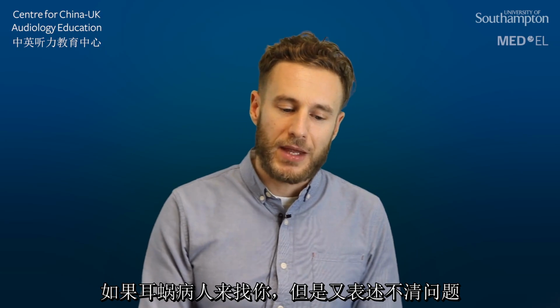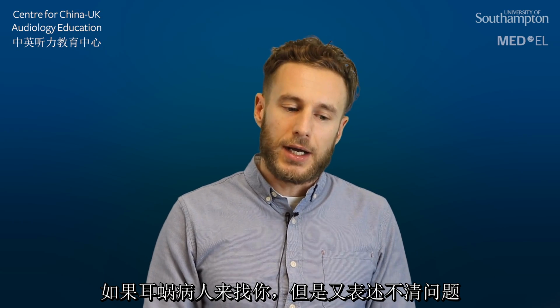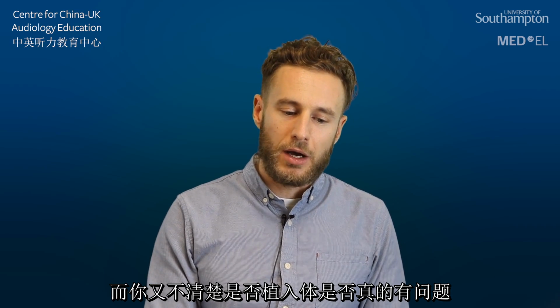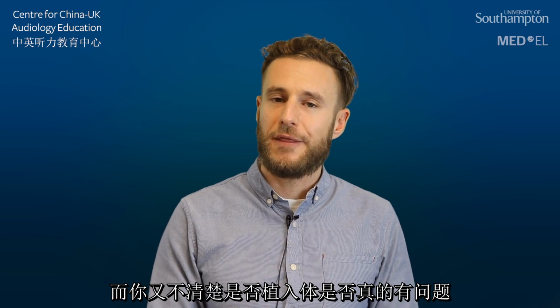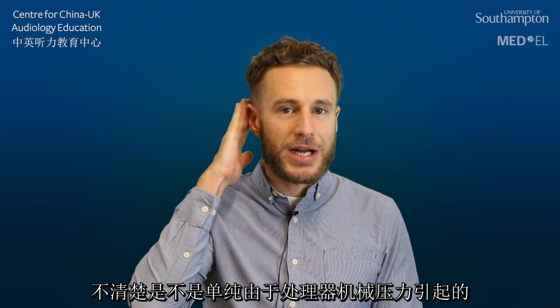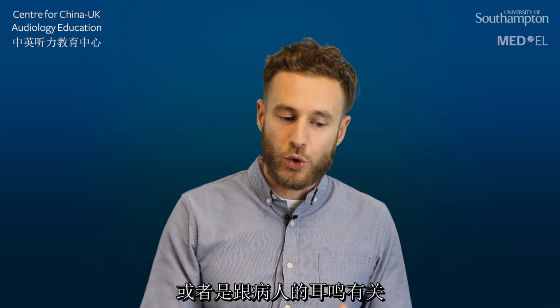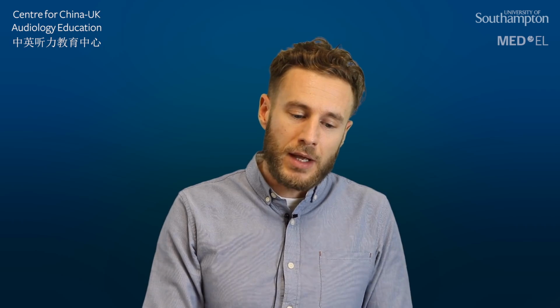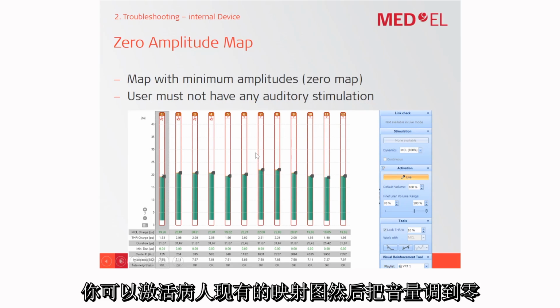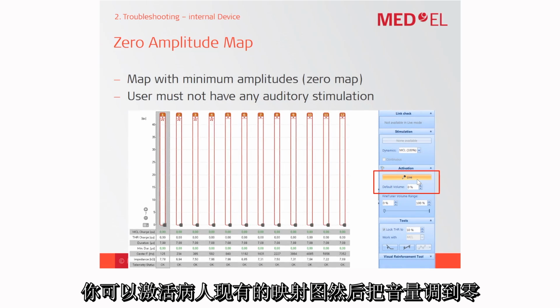As already mentioned, if a CI user comes in with a really doubtful problem description and you're not sure whether this is really associated with the implant or is owed maybe because of mechanical pressure from the processor coil, or also because of tinnitus, for example, then you could just apply a zero amplitude map, either with the existing map of the patient by just activating the map and then setting the volume to 0, and in the next step you would then lower all the MCLs to 0.